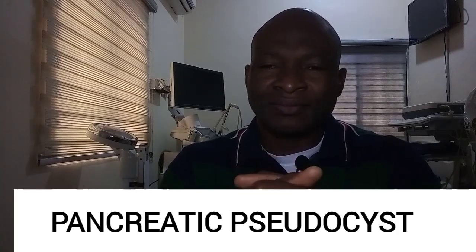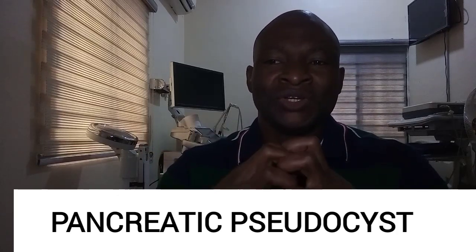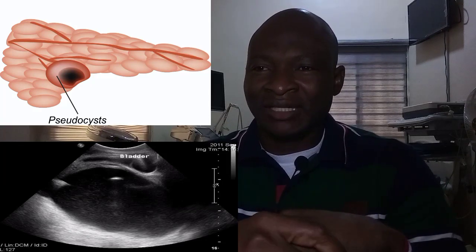Later, often after 6 weeks, a distinct wall encapsulates the fluid, forming a cystic structure. This cystic structure lacks a true epithelial lining and is defined by organized fibrous tissue that borders around it, and that's why it's called a false cyst or pseudocyst. And this is an example of pseudocyst on ultrasound and in a drawing.